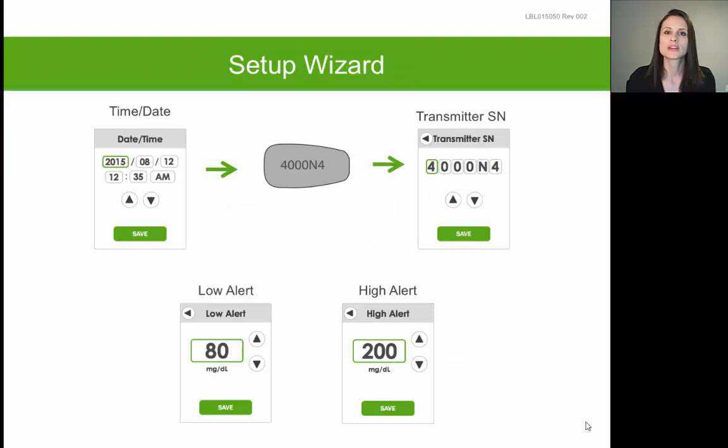Once you've entered the correct date and time, the receiver will ask you to enter your transmitter serial number. Your transmitter is a very small gray rectangular piece that comes in a different box than the receiver. It comes in a small white and green box that has a photo of the transmitter on the outside.